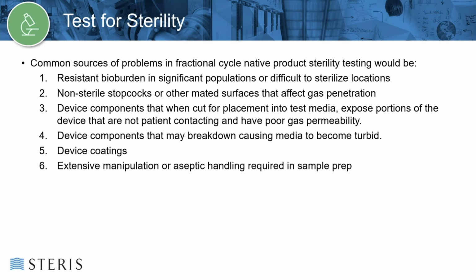Typically in a sterilization validation, we perform comparative resistance at a sublethal exposure to the sterilant. Our goal here is to show that the product bioburden is less resistant to the sterilization process than the biological indicator organism used throughout the remainder of the validation study. This comparison ideally shows no growth of the product bioburden after the sterilant exposure, but some survival of the indicator organism. The test of sterility of the product is a qualitative test, meaning it yields a positive, or growth, or negative, no growth result.